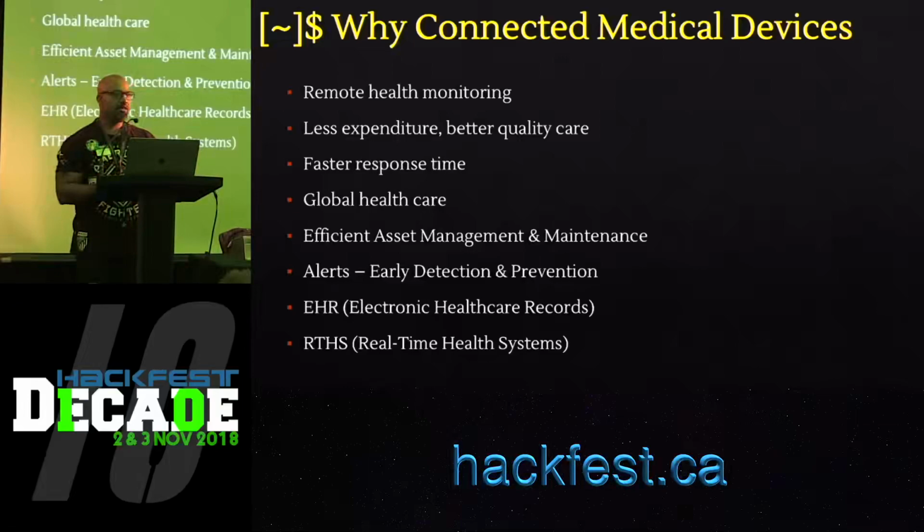And then the future of connected medical devices is going to be EHR and RTHS. EHR are electronic health record systems, where all this data is aggregated and then saved for future analysis. But EHR were never meant to interact with medical devices in real time, so they're limited in their capability as to what they can do. But RTHS, which are real-time health systems, are more able to take that kind of action and interact with different devices.